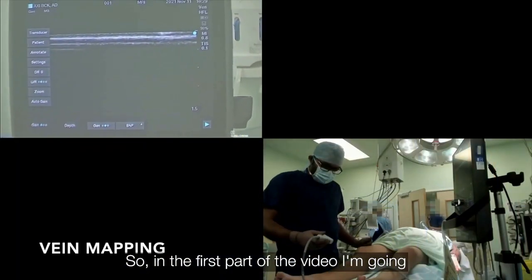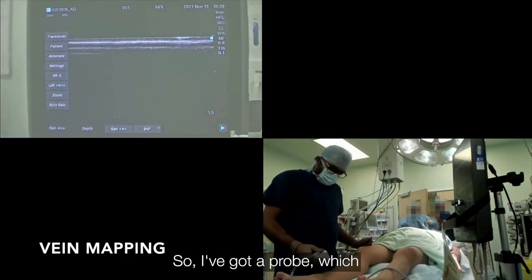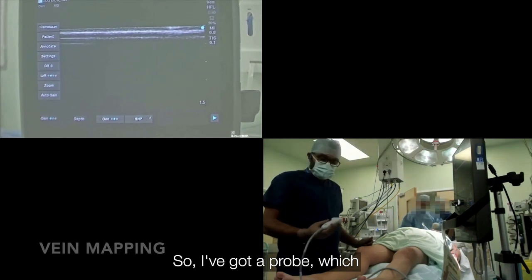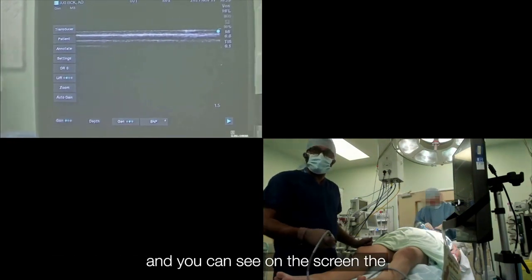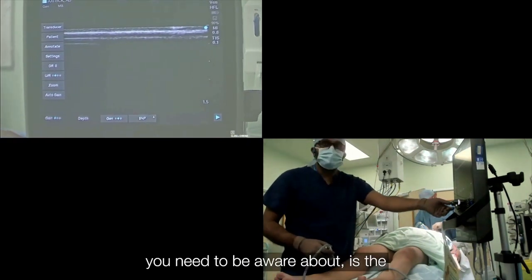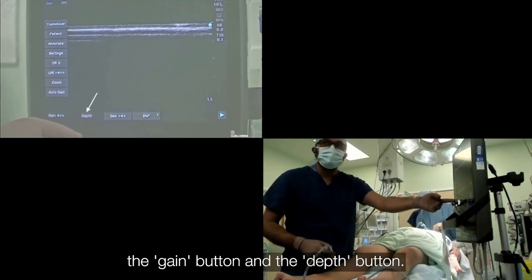The first part of the video, I am going to show you the vein mapping. I have got a probe, which is a superficial probe. You can see on the screen the center side. The few buttons you need to be aware of are the gain button and the depth button.